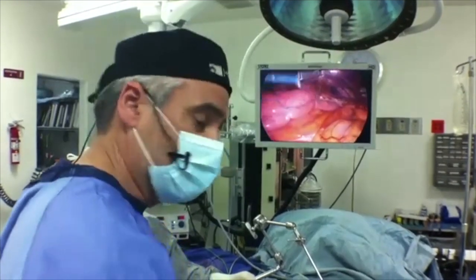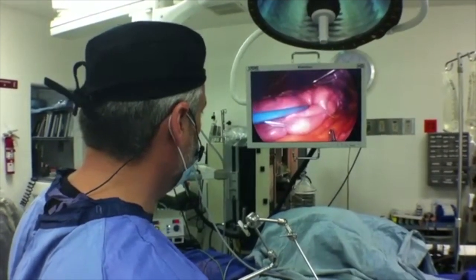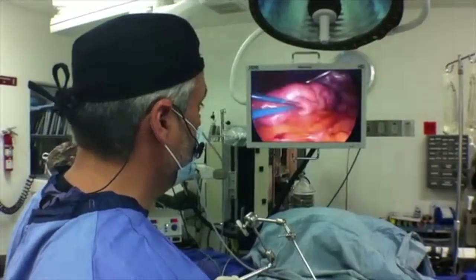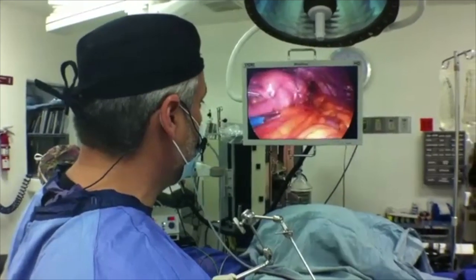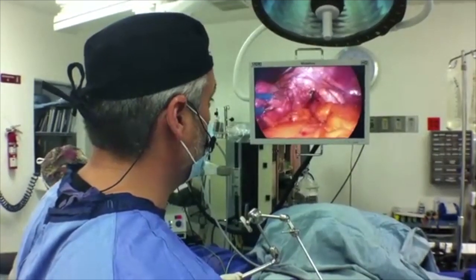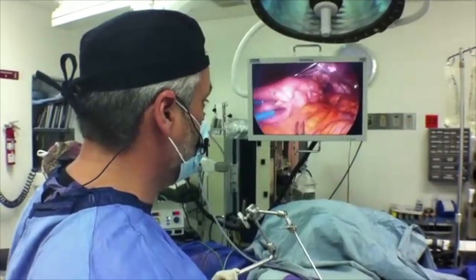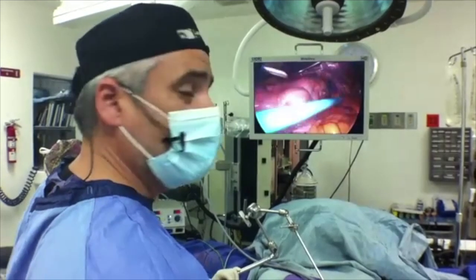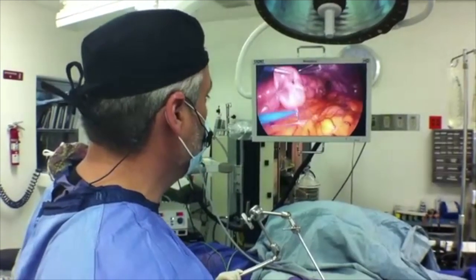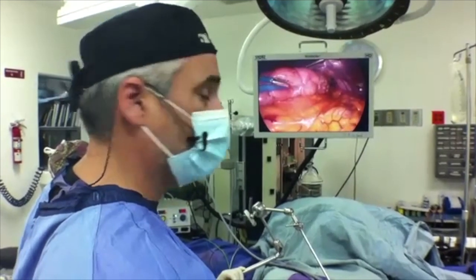This is the first line of stitches. What we have here is a stomach with the first line of stitches — note that it looks tubular. We have the calibrated tube inside. This first line's intention is to just form the tube that will assist on the second line, which is the important line — the one that contains the plication. Both lines of stitches are permanent, but if the second line were to disrupt theoretically, it would not cut between the stitches causing ischemia, obstruction, and perforation.